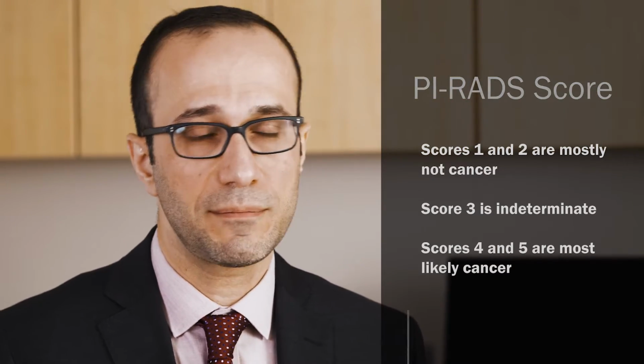If you have already done this imaging modality by the time you're watching this video, probably you are familiar with something called the PIRADS scoring system. It's basically a system that ranges from 1 to 5, with 1 being the least suspicious area inside your prostate, and 5 is when there is a lesion that is very suspicious based on certain characteristics to the radiologist and requires a biopsy. In today's practice, it's very common to recommend that a patient would need a biopsy if the PIRADS score of a certain lesion is a 3 and above.